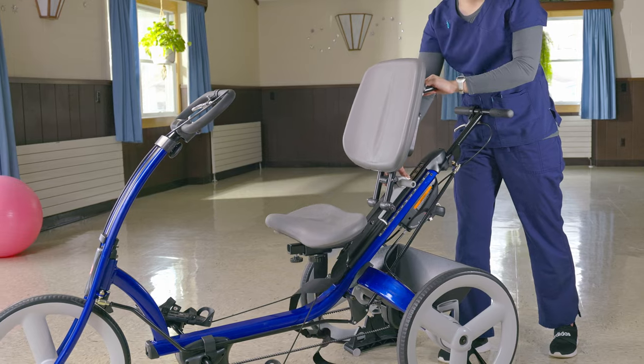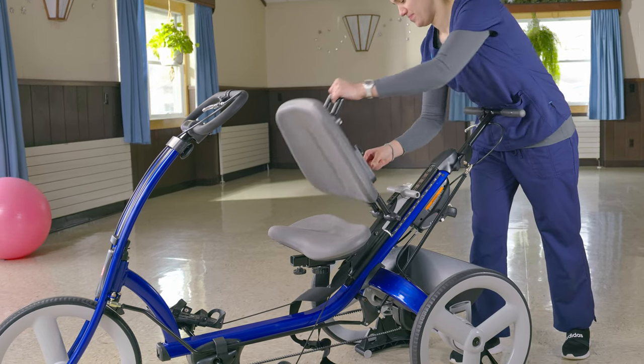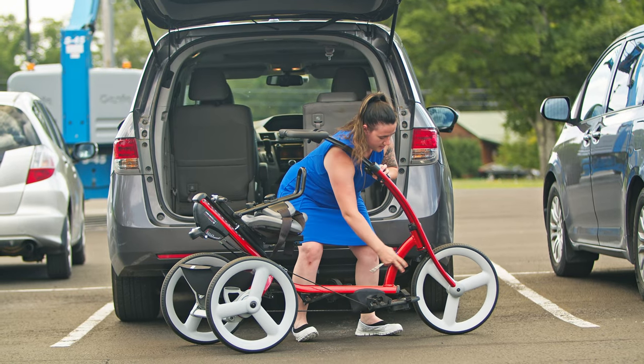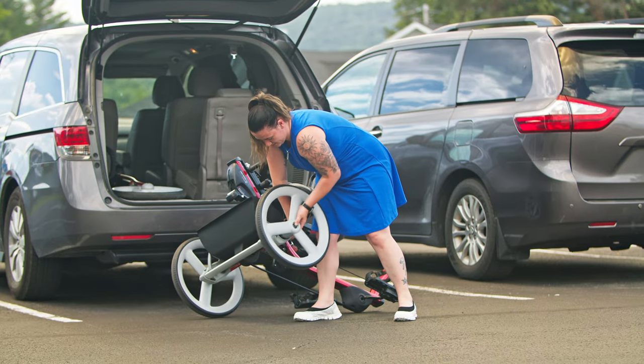For transport, if we lower the seat, flip the backrest down, and then lower the handlebar, it will fit into most minivans. To make it even smaller, we can remove the front end and remove the rear wheels.